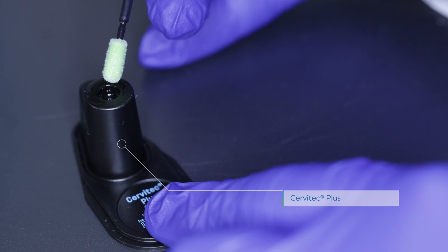Now, this is something that nobody does. You say, Shannon, why are you doing this? Well, first of all, remember that in our treatment plan, if the doctor has to do interproximal reduction, we are removing some tooth structure. And remember, that is not something that a dental assistant can do. It is against the law in every state. We cannot use interproximal reductions. We're using the contact ease to go in between and make the teeth just a little bit smaller. So this way we can get movement.